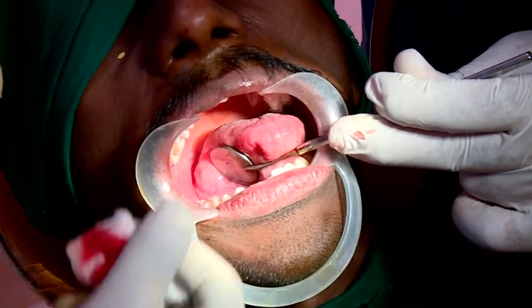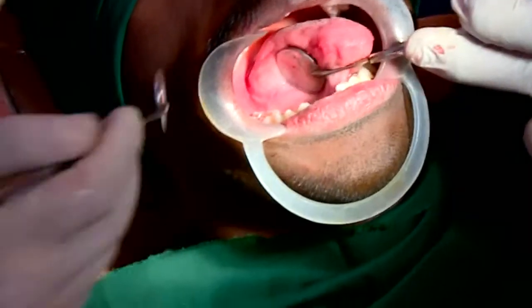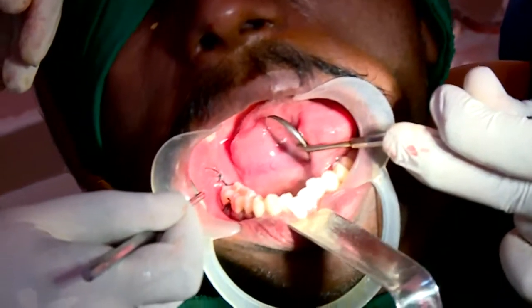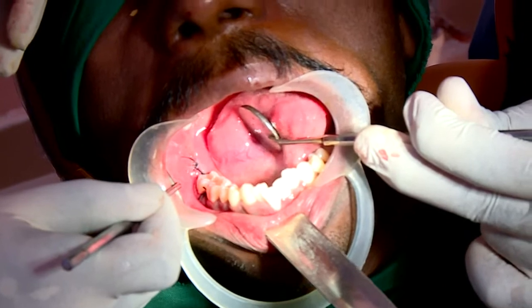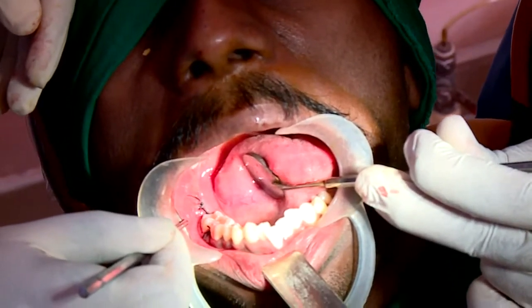These are the instructions that you will give a patient. We have done a normal inspection. The entire closure has been done, sir. No brisk bleeding. The entire wound is closed, and the patient is comfortable.